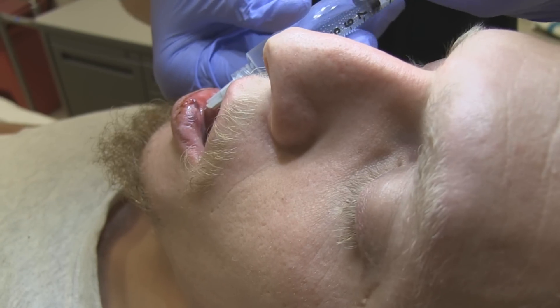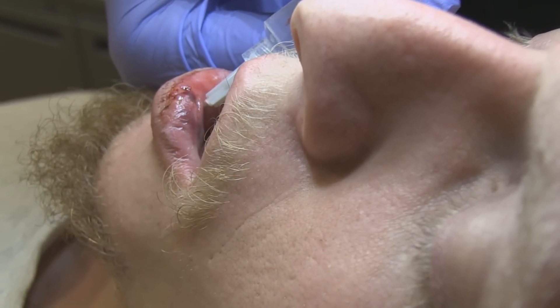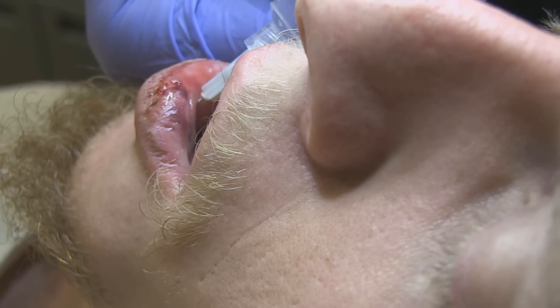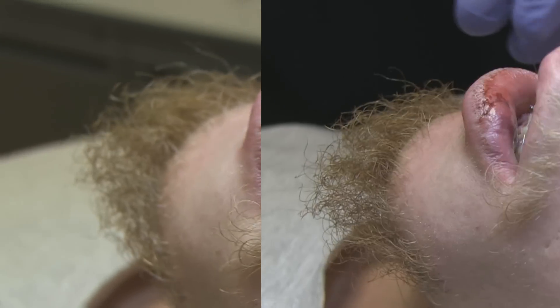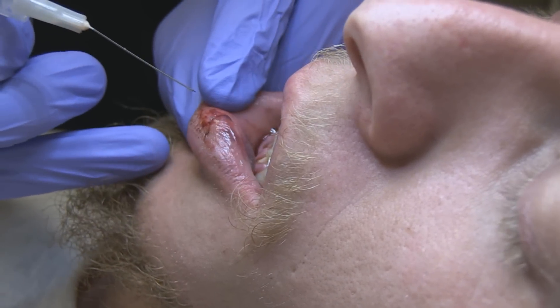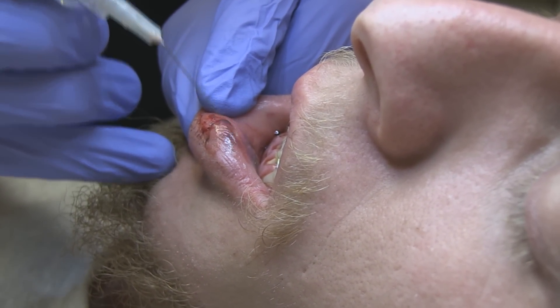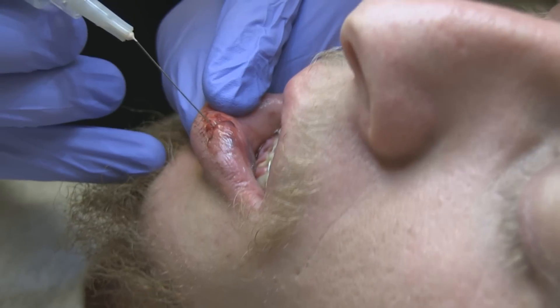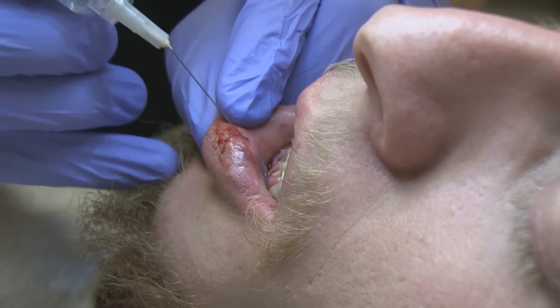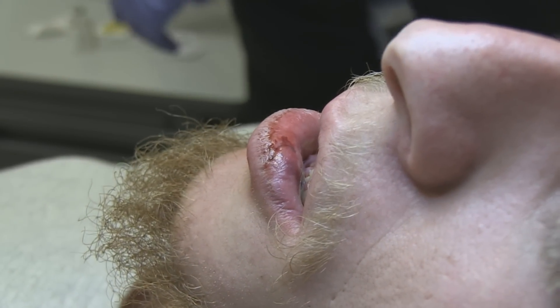Direct a little more inferiorly. Tell me if you feel what sensation you feel when I poke on your lip here. Do you feel that at all? Not at all. Looks like your mental block worked — our mental block was pretty effective.